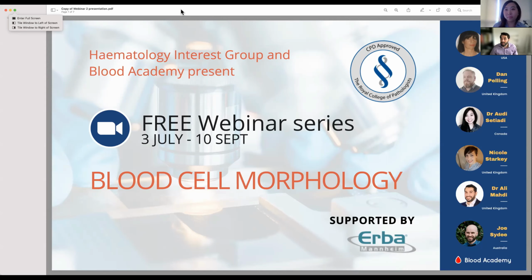And I'm really delighted to be joined by Dr. Audi Setiadi, who's based in Canada. We have 3 very interesting cases, and there's a lot to learn during this session as well. So please stay focused on the cases, and hopefully we'll bring up some interesting discussion points as well.